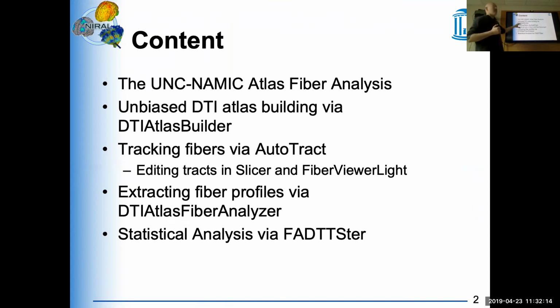The things we will talk about are these different steps that are used in this analysis framework. The main thing is this is a fiber-based analysis framework. So we're extracting fibers and then analyzing the information with respect to those fibers, such that we have a fiber-specific analysis and not what is in TBSS, which is a localized analysis, but not specific to a fiber, more to a certain region close to the white matter skeleton.